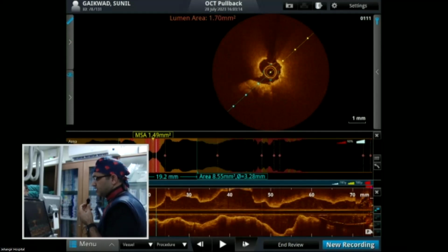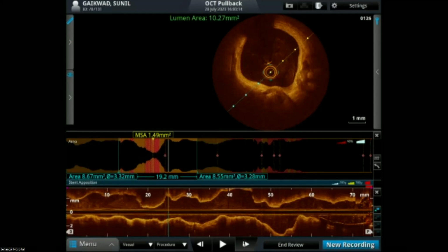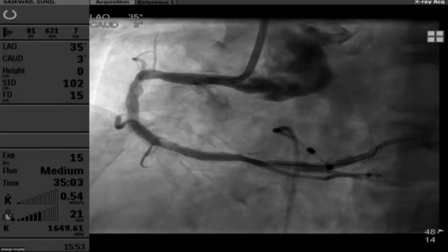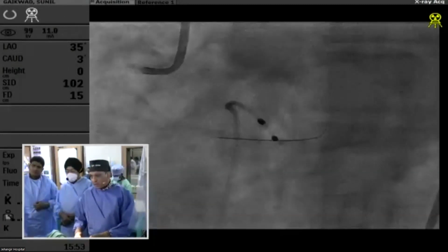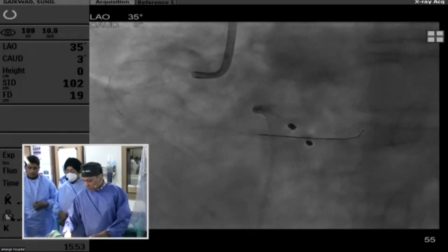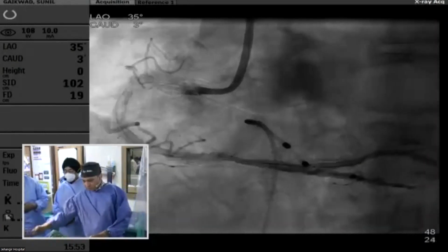Yeah, we have to break off to go to the next slide, but thank you for sharing those images with us. So the last image, we'll just show you the angio image here after 1.5 and after 1.75. Can we run the video? Yeah, perfect. We see it. So there's still good flow, and the lesions definitely look a little better. And OCT showed that you have modified the plaque a little bit.